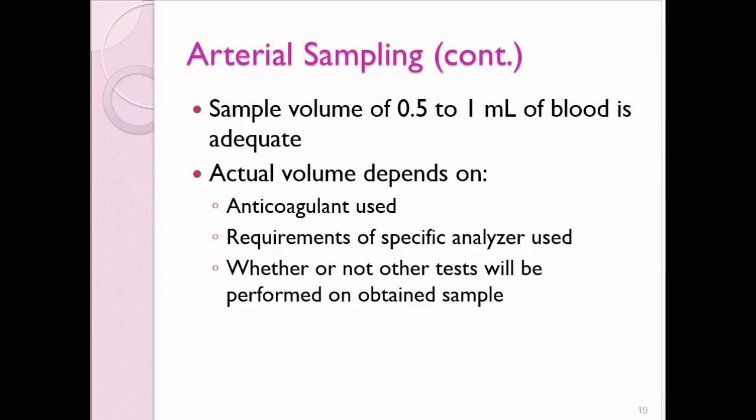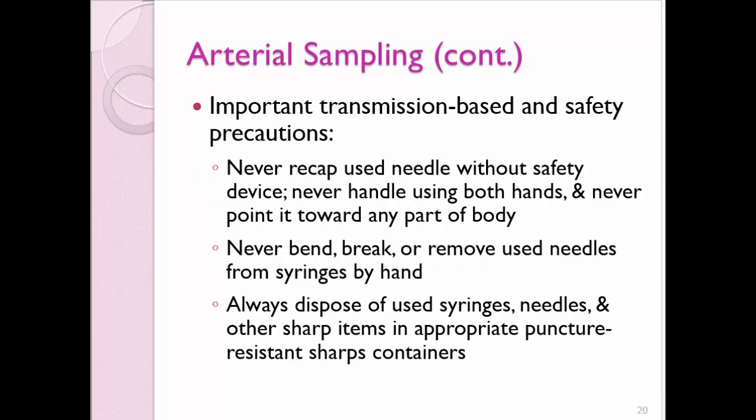So it's not uncommon for us to draw blood for the lab or even some for the nurse if they need to do a glucose test or something like that. So you can always get more if you need, but typically it's less than 1 ml. Safety concerns? You never recap a needle without a safety device. You never handle using both hands and never point it toward any part of the body. This is very important because needle sticks are a very common injury in the hospital, and they're not fun for anybody involved.